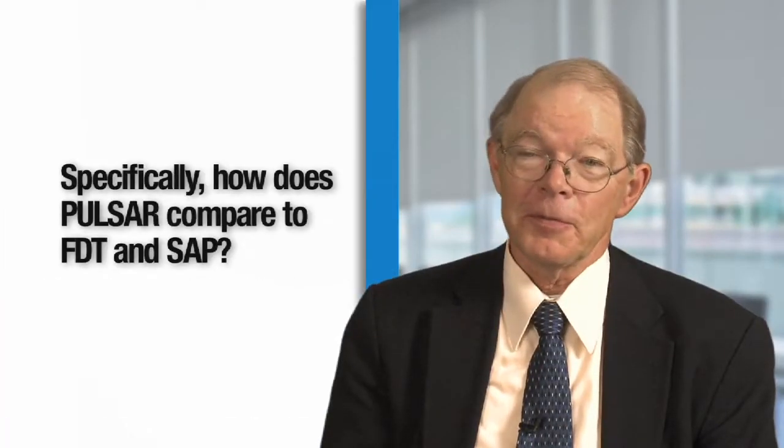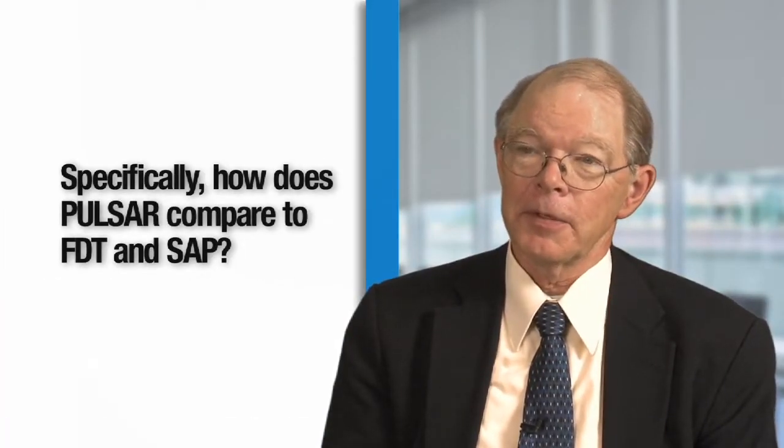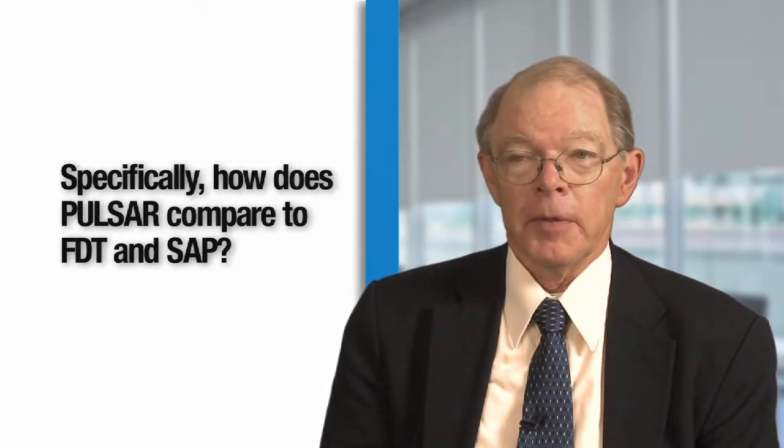What are the differences between frequency doubling and standard automated perimetry? Well, standard automated perimetry is an increment threshold. You have a uniform background and you present a small increase in light at a localized region and look at how much light has to be added to that background to make it just detectable. So it's called an increment threshold. Frequency doubling uses contrast where it has light and dark bars that are present, and it measures how light and how dark those bars have to be to make it just detectable from a background.